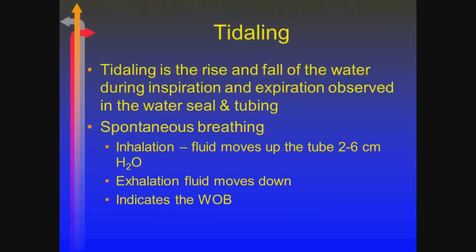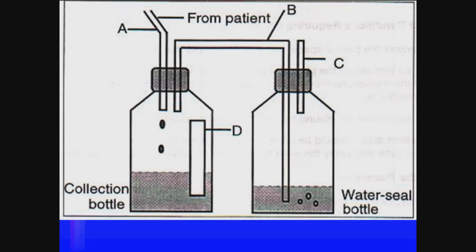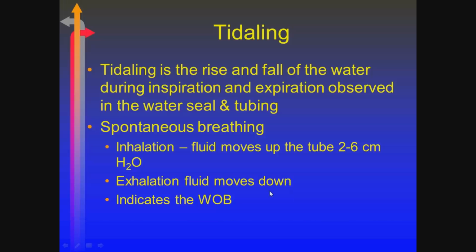The term tidaling is referring to the rise and fall in the water level that occurs during spontaneous breathing. So during spontaneous breathing, there's a movement of fluid up on inhalation and a movement of fluid down on exhalation. Negative intrathoracic pressure during the inspiratory phase causes fluid to move up this tube, and during exhalation goes the opposite direction.